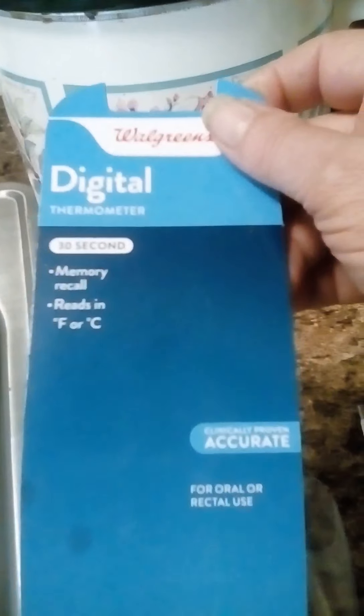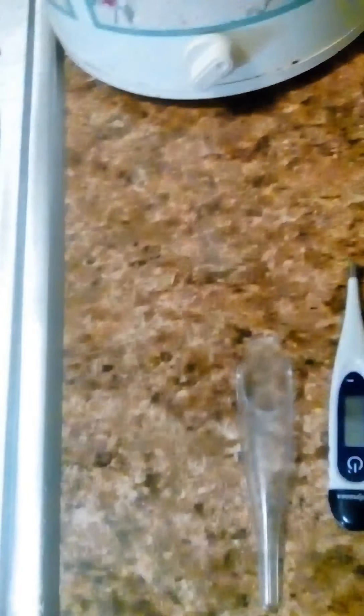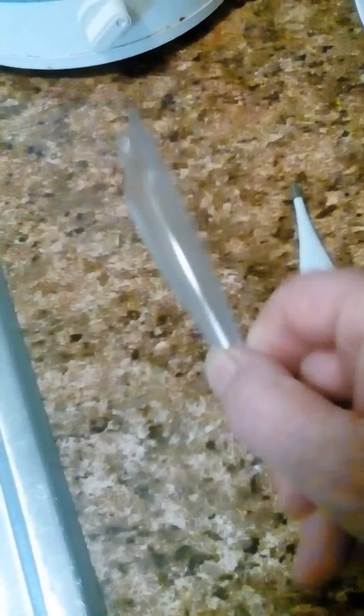It's clinically proven accurate. This is the cover that goes on it, and here's the thermometer.